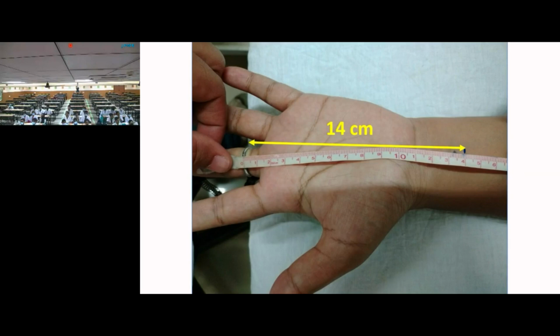Now you know the distance between the active electrode and the stimulating electrode. This is a stimulus point, and this is the point where we are going to record the stimulus. So you know the distance is going to be 14 centimeter.